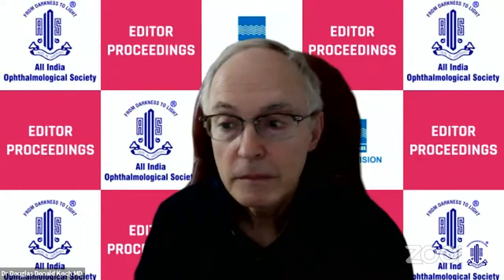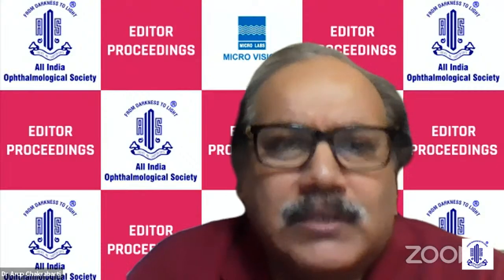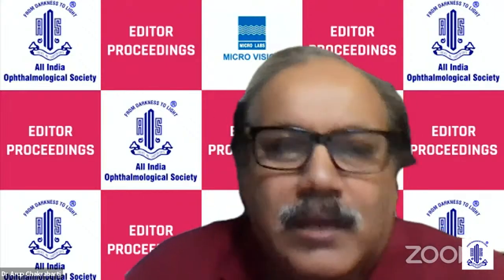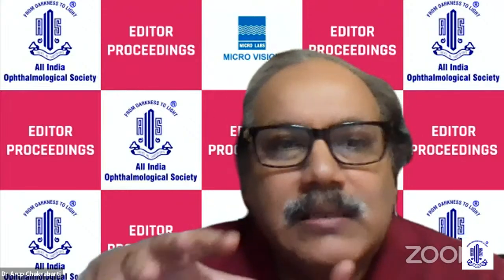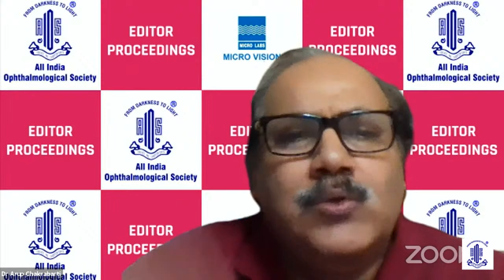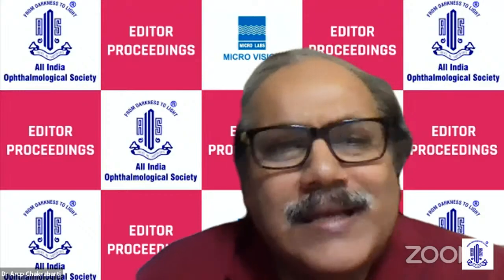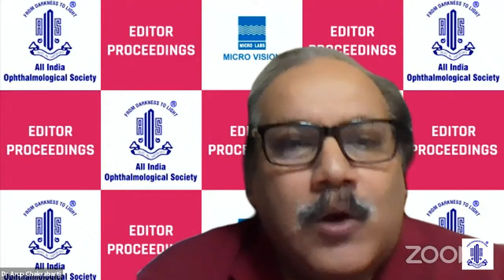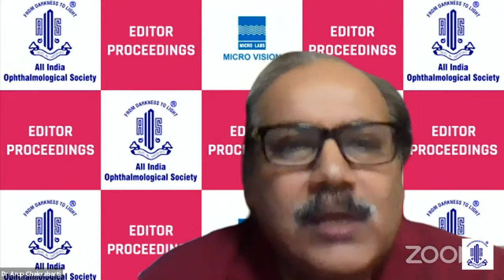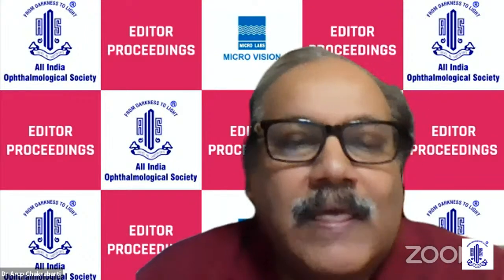Right. So about 10 years back, I was doing my A constant optimization routinely for most of my patient surgeries. But now I have realized, and I have learned a great deal from teachers like Doug and others, that since the surgical technique is more or less constant, and the lenses we are using have an international footprint, a huge number of lenses have already been fed into the software to get the A constant. That has been giving us very good results. The only problem occurs when you're dealing with a new Indian lens, which usually will not be part of those formulas, and then there's a problem.